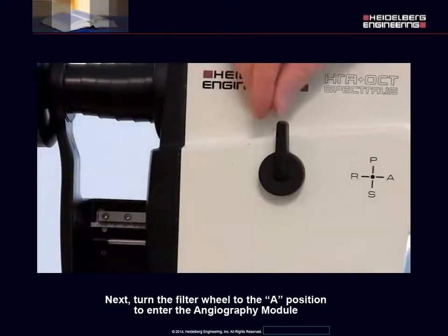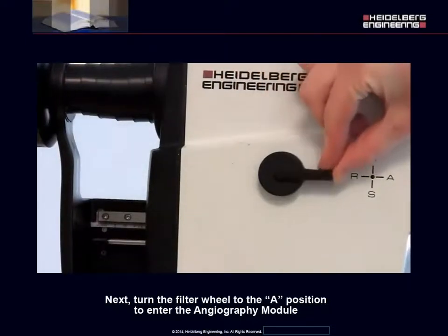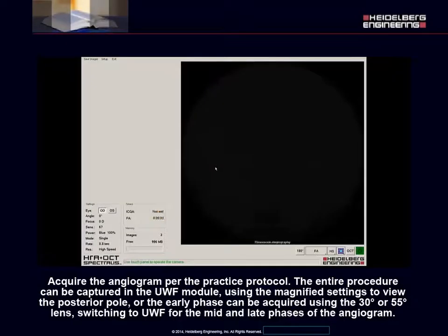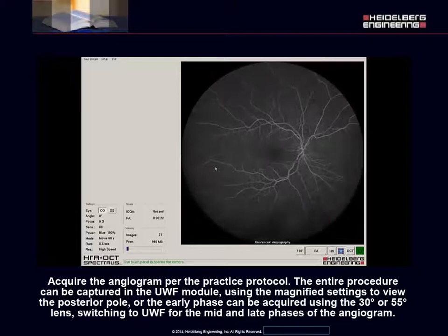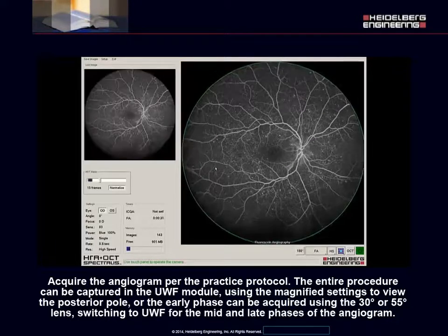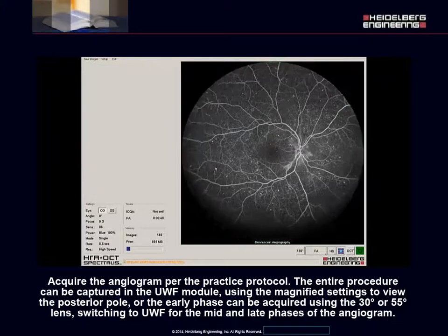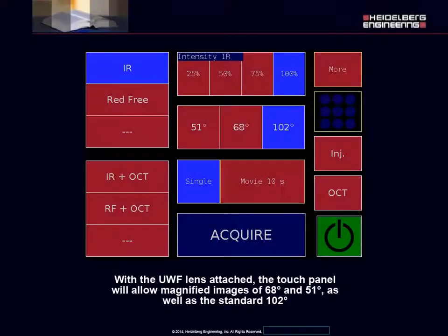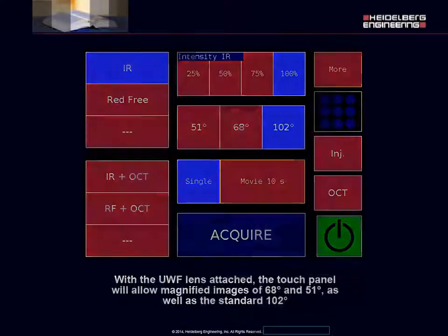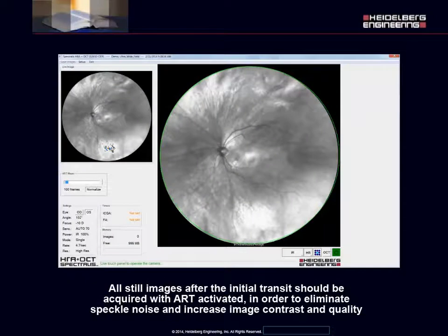Next, turn the filter wheel to the A position to enter the angiography module. Acquire the angiogram per the practice protocol. The entire procedure can be captured in the ultra-wide field module using the magnified settings to view the posterior pole, or the early phase can be acquired using the 30 or 55 degree lens switching to ultra-wide field for the mid and late phases of the angiogram. With the ultra-wide field lens attached, the touch panel will allow magnified images of 68 and 51 degrees as well as the standard 102 degrees. All still images after the initial transit should be acquired with ART activated in order to eliminate speckle noise and increase image contrast and quality.